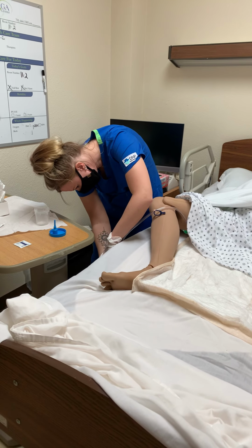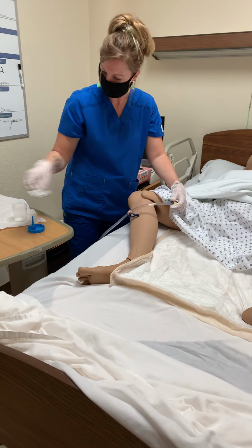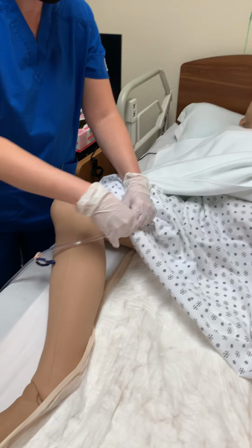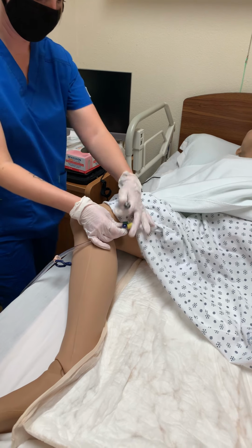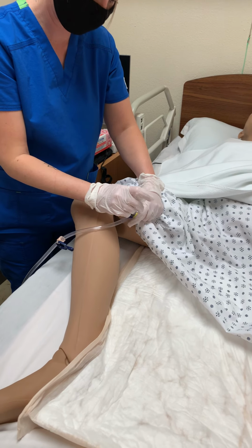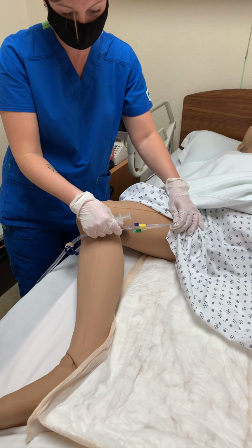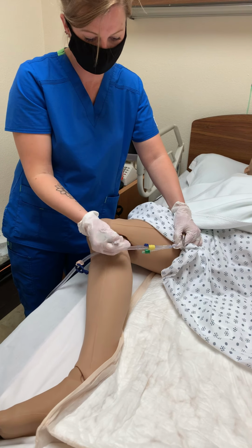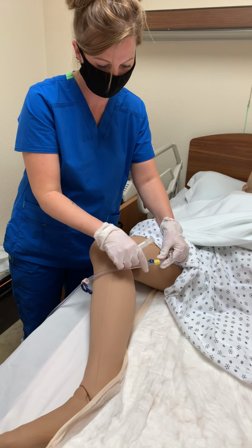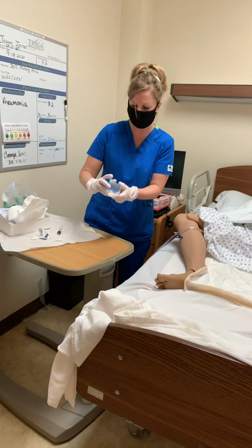I would take this, I would clean it with an alcohol pad. I would take a needle, a syringe, which I know I have, and I would insert it in here, and I would pull any urine out that's in the line. If there is no urine in the line, I would clamp it. Let urine go through. I would clamp it to stop the airflow with these, and then I would try to take it out as well. Okay, I would insert it in here. I would label it appropriately, name, date of birth, time it was taken, who it was taken by, order. I would bring it to the lab.